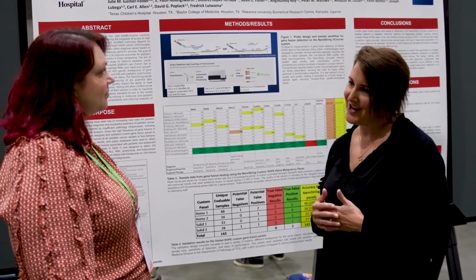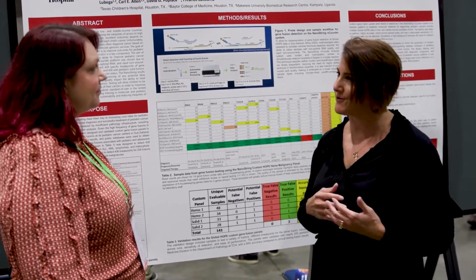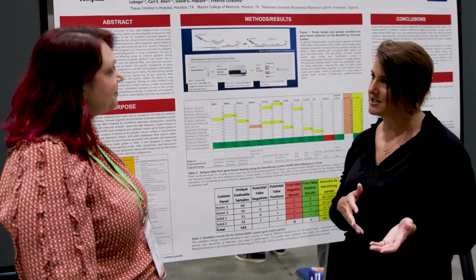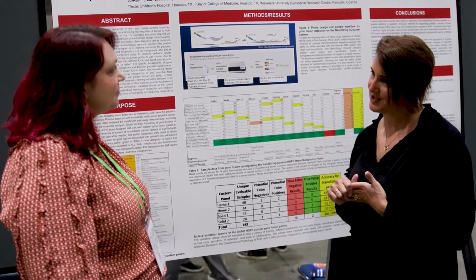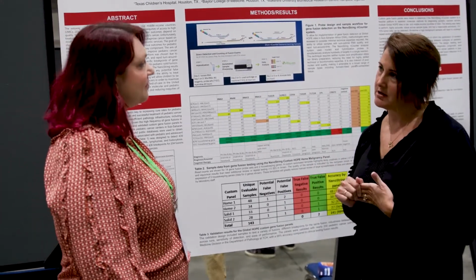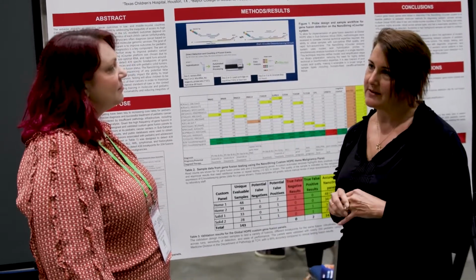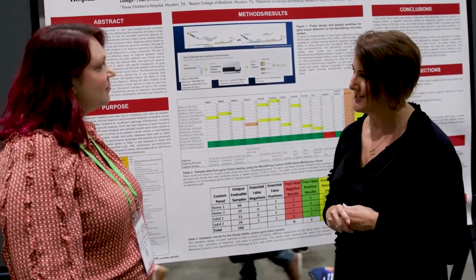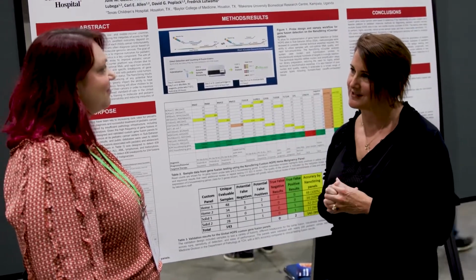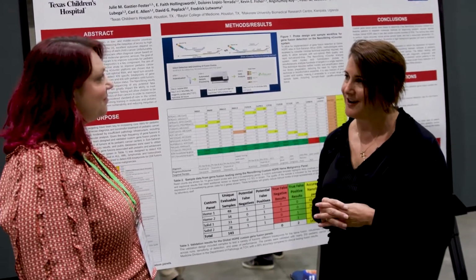We don't know the makeup of the genomics of the kids in Sub-Saharan Africa. We know what's more frequent here, but we don't really know there. So we went very broadly, built a very large hematologic panel and a very large solid tumor panel, and tested it in Houston with known samples, with known fusions, about 150 samples. And we are just now getting ready, actually this week, to ship to Uganda and deploy the Nanostring nCounter as well as the fusion assays to start implementing over on site.